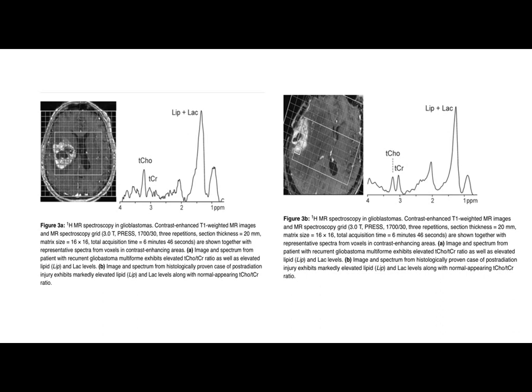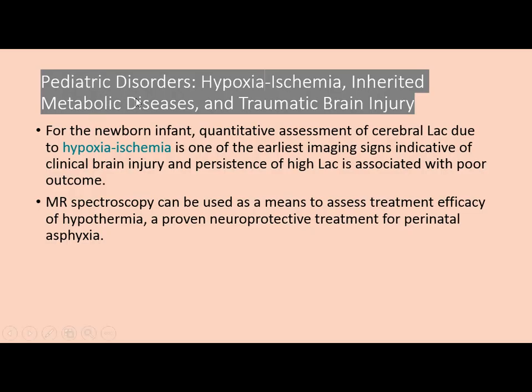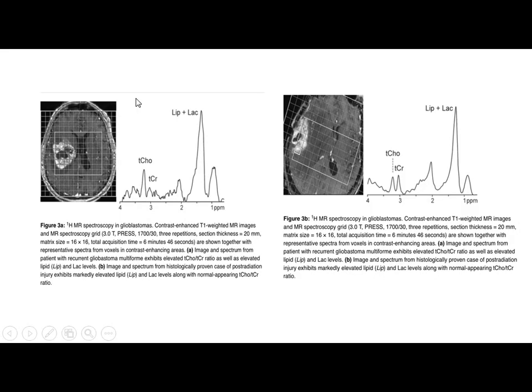But with the spectroscopy, the elevated choline related to creatine indicates high cellular membrane. A lot of cellular membrane, indicating it's a recurrence. We should take the sample from the periphery of the mass. They are doing a multivoxel. You can see here, even in the normal area.